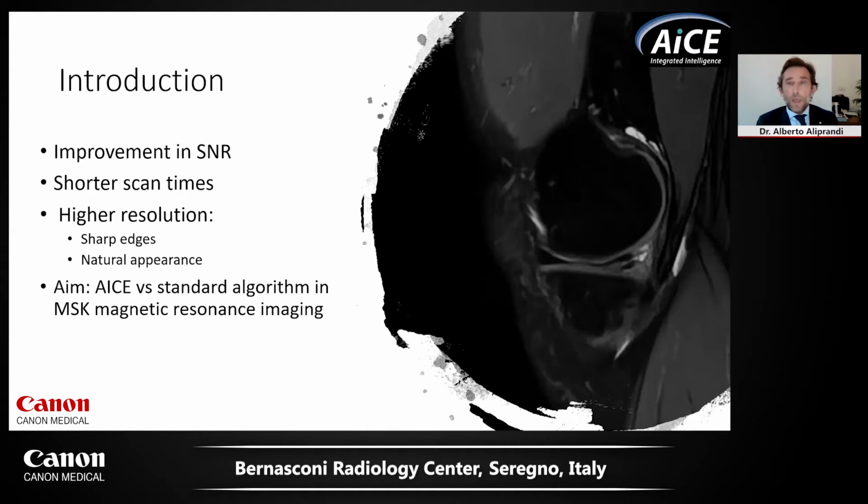For example, in this proton density image of knee, we can observe a horizontal complete posterior tear of medial meniscus with a perfect delineation of a small meniscal cyst, not so easily recognizable with the standard MR images.